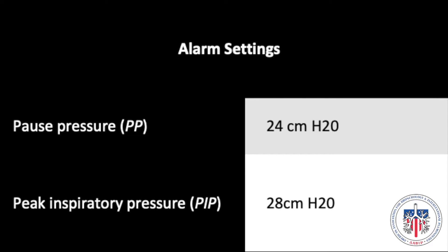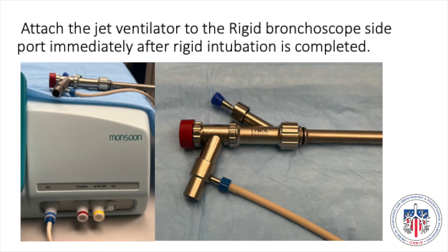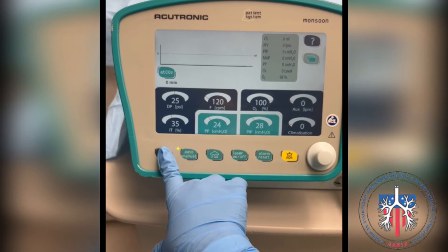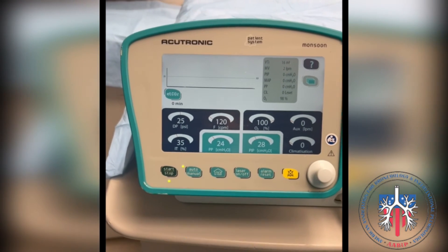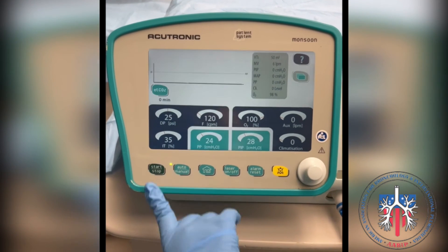Alarm settings are set at a pause pressure of 24 centimeters of water and peak inspiratory pressure of 28 centimeters of water. The alarm settings are shown here. Attach the jet ventilator to the rigid bronchoscope side port immediately after rigid intubation is completed. Press the start button to initiate ventilation and press again to stop ventilation.